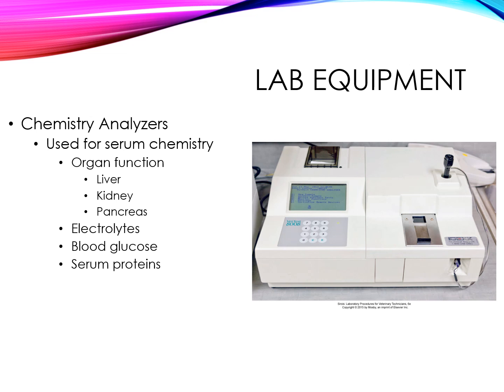So the chemistry machine runs all of this, and chemistry machines usually require more quality control and maintenance than the hematology analyzers. So this is one of the machines that you may have to do a lot of quality control on.